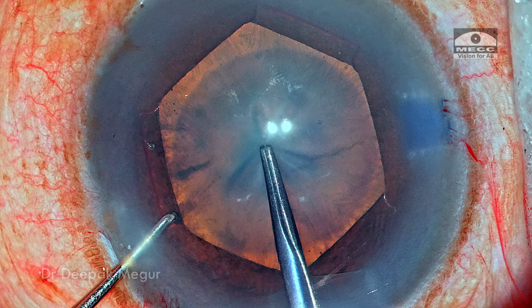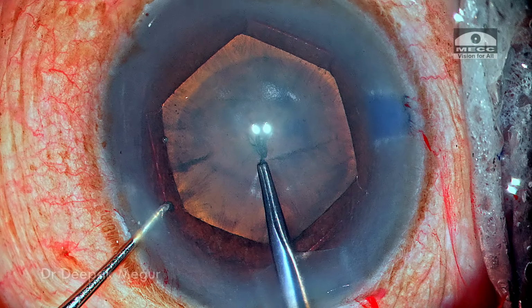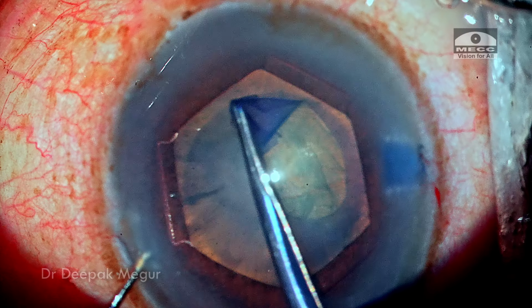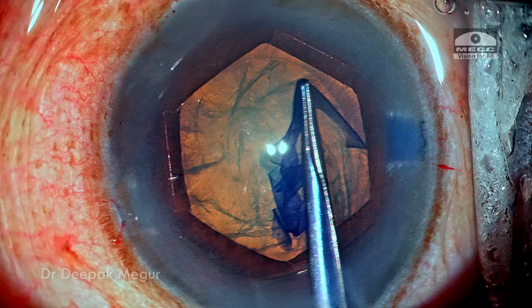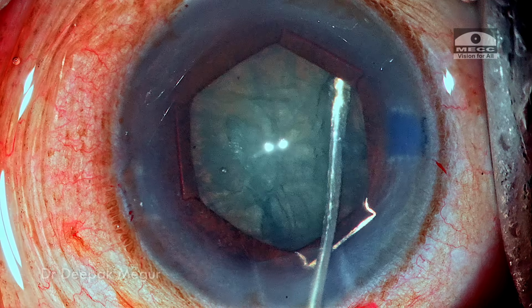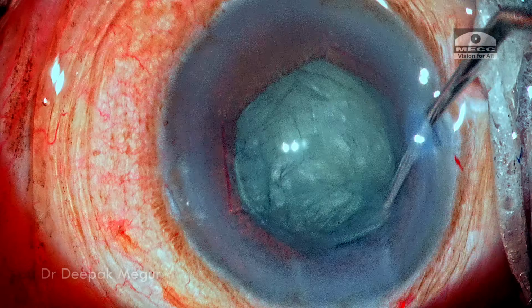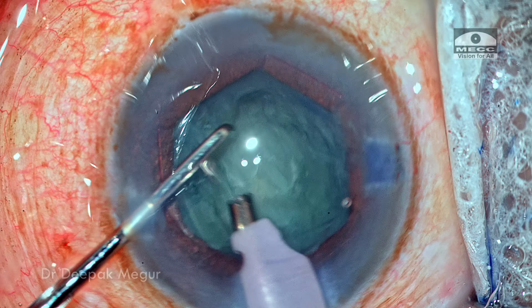As I'm puncturing the anterior capsule, there's just a little hint of folds on the anterior capsule, suggesting that there is no major zonular weakness, and the rhexis could be completed quite easily. It's about 5.5 millimeters. Time to perform the hydrodissection. The nucleus rotation is confirmed. And now is the time to emulsify the nucleus.